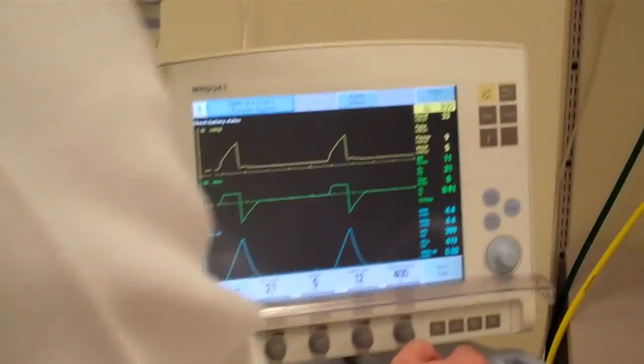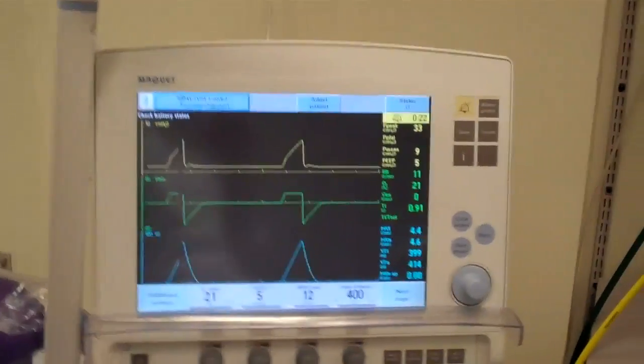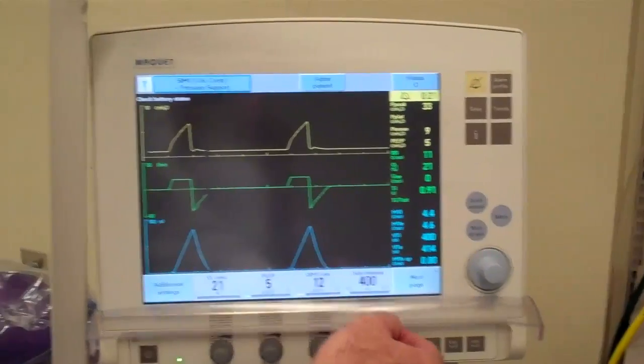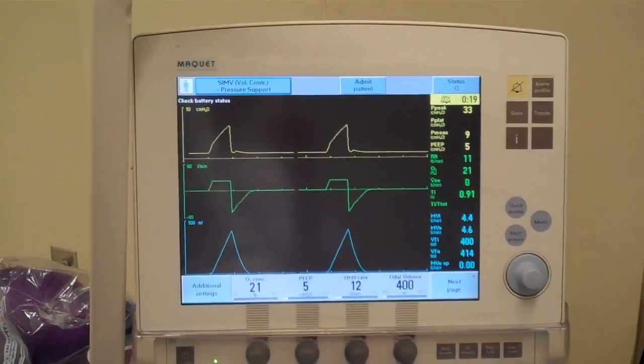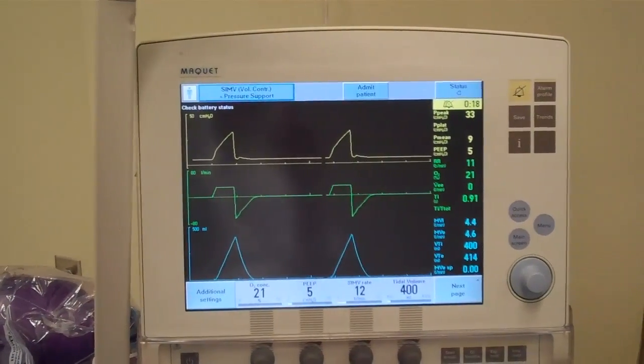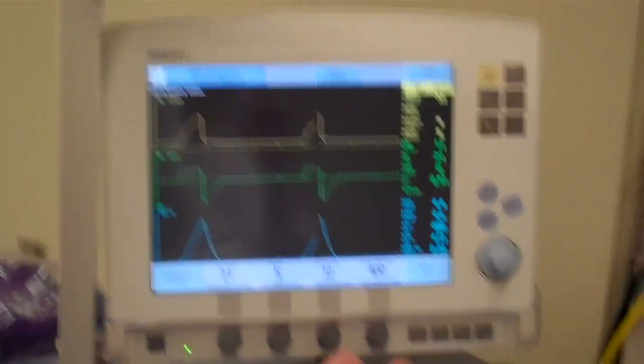That's how you do the plateau pressure to assess your static compliance.